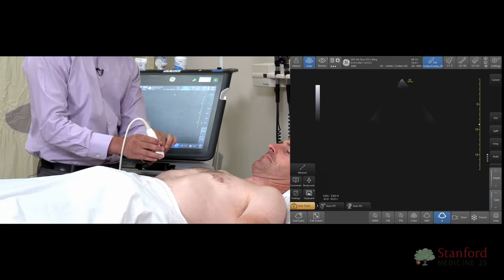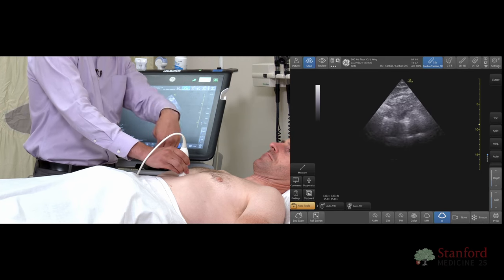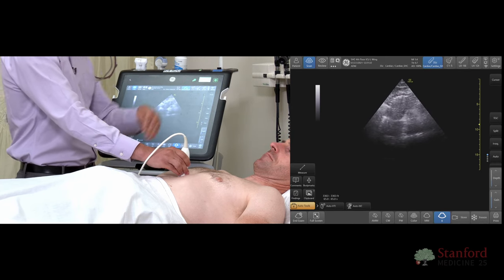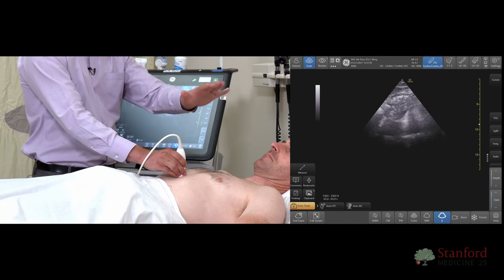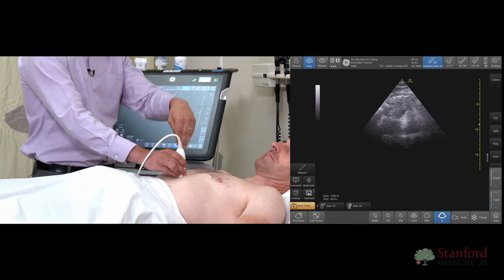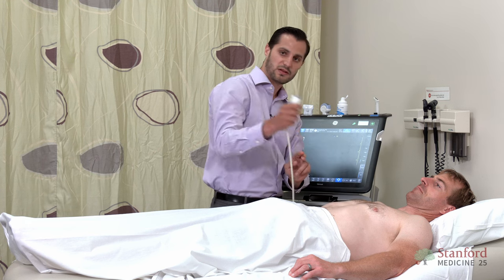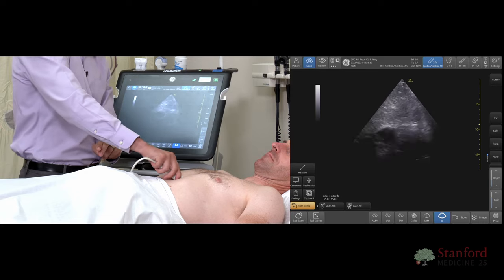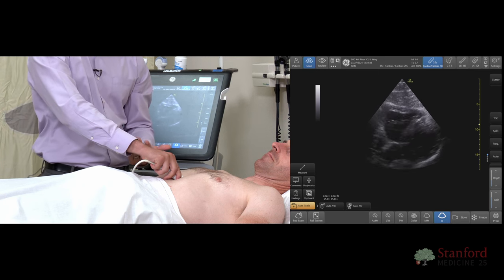Another common error is individuals who point the probe almost perpendicular to the chest. When you do this, you can imagine the heart is up on the left side — you're not able to visualize it well if the probe is pointed straight down. All you have to do is take an overhand grip like a remote control and drop your probe so it's almost parallel to the patient's body, and that can bring the subcostal into a better view.